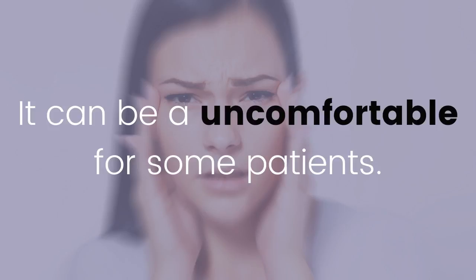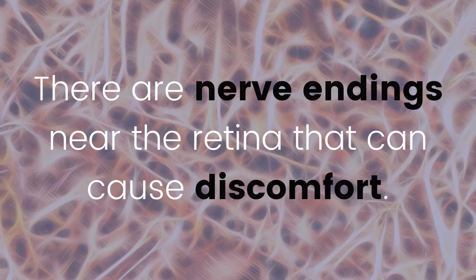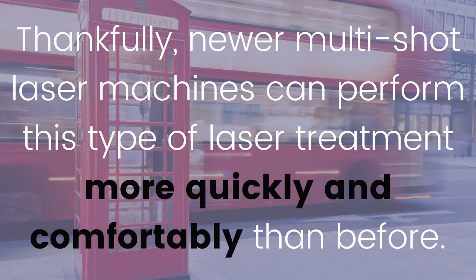It can be uncomfortable for some patients. There are nerve endings near the retina that can cause discomfort. Thankfully, newer multi-shot laser machines can perform this type of laser treatment more quickly and comfortably than before.